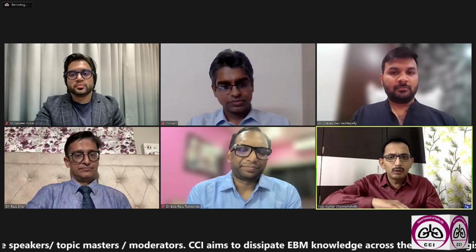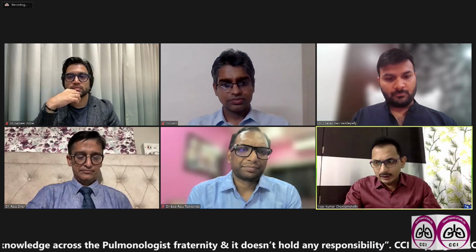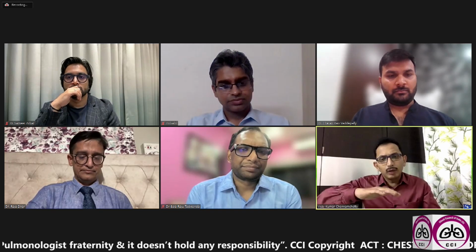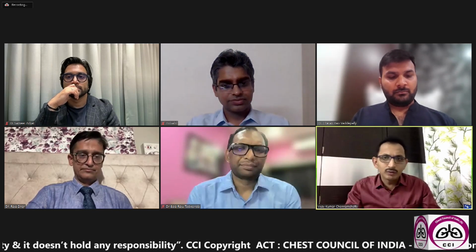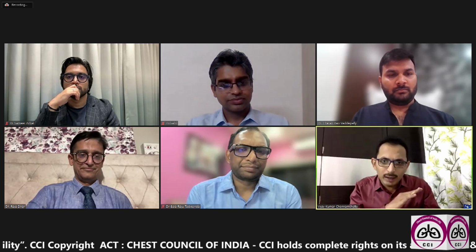I started using cryo back in 2017. In the first year, we are compiling the data now to publish it. We have somewhere around 210 to 220 cases roughly, and it's in the process of being published. In the initial year, we had a good number of pneumothoraces, probably 6-7 cases in the first year, followed by a gradual dip. And in the past 1.5 to 2 years, we have almost never had even a single case.